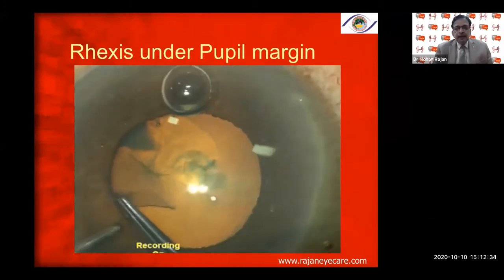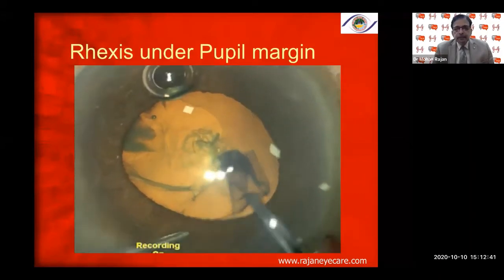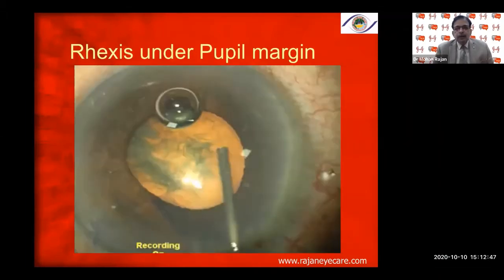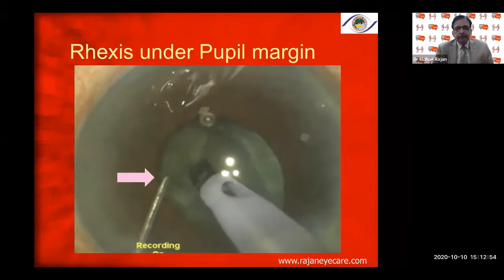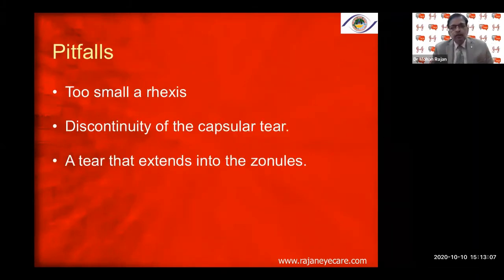Performing a rhexis underneath the pupillary margin requires a little bit of experience. Always follow the margin of the rhexis, re-grasp every three clock hours. When you have a small pupil, you can make a rhexis slightly larger than the pupil size. You can use iris stretch, iris hooks, multiple sphincterotomies, or sector iridotomy before the capsulorhexis. Normally, when the pupil is very small, use iris retractors and then proceed.